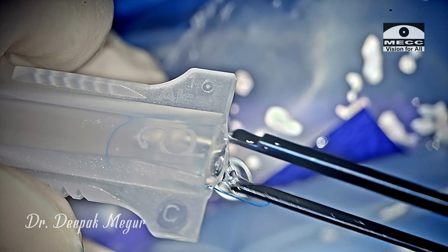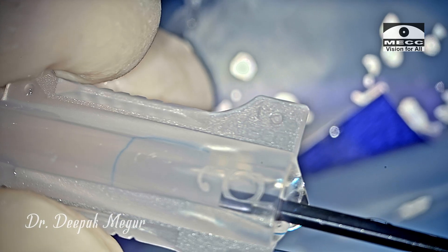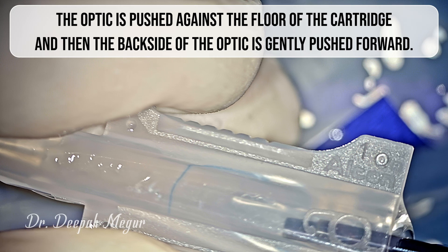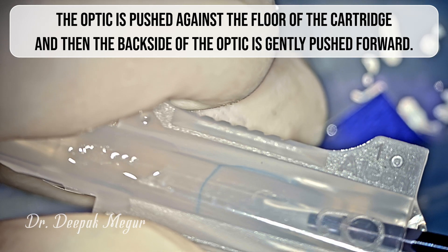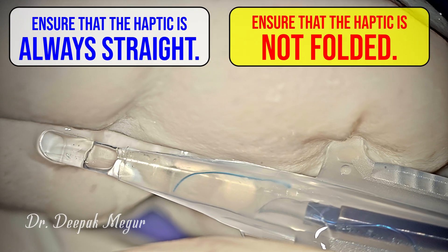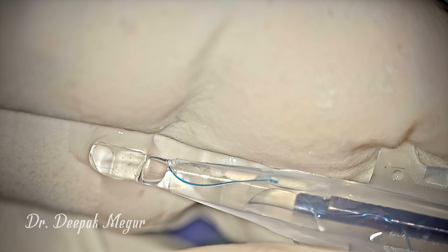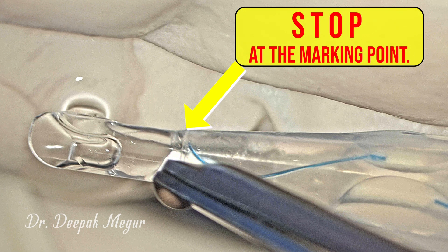Once it is slightly straightened, the optic is gently placed inside the cartridge. The optic is pushed against the floor of the cartridge and then using the forceps the back side of the optic is nudged forward. It's important to note that the haptic continues to remain straight rather than getting bent. The optic is pushed until the haptic reaches the mark, then we stop.